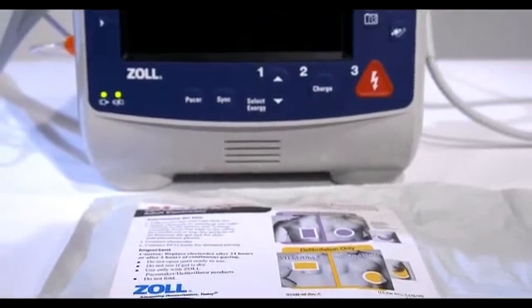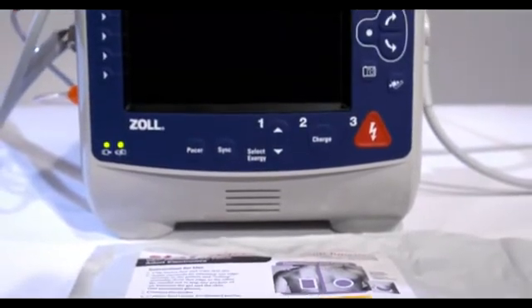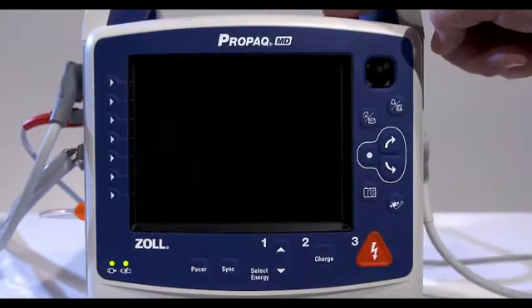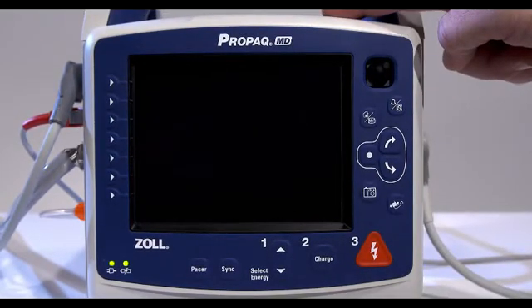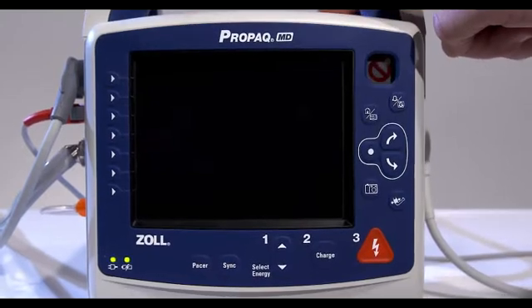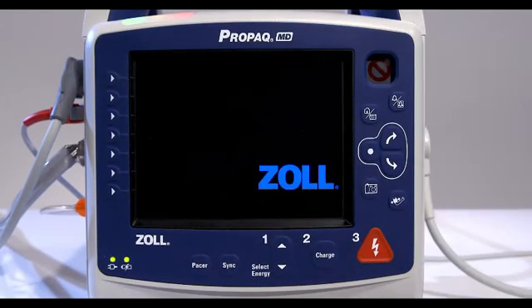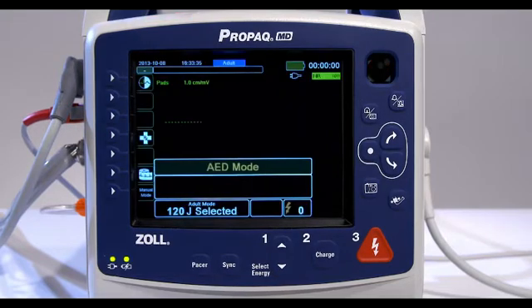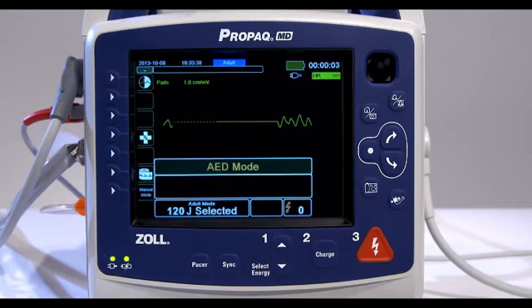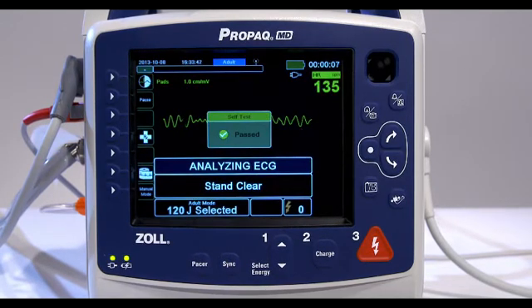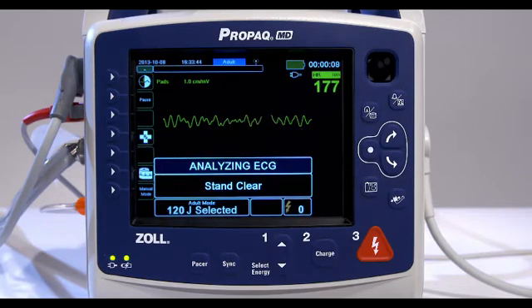Let's review how to use the ProPakMD in the AED mode. The unit may already be configured to begin in AED mode. In AED mode, the ProPakMD automatically begins the analysis of the patient's ECG rhythm, displays an analyzing ECG message for 5 seconds, and announces and displays a Stand Clear message.